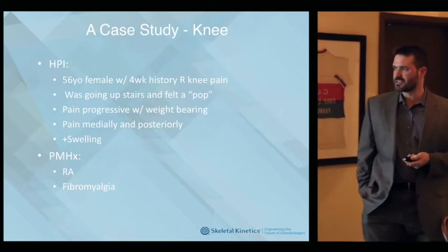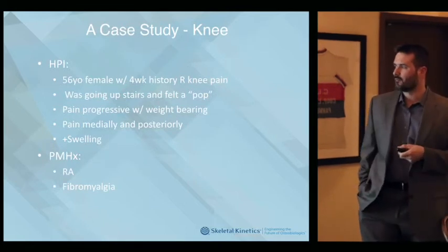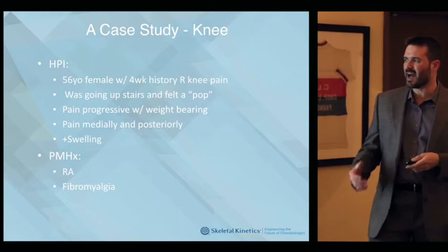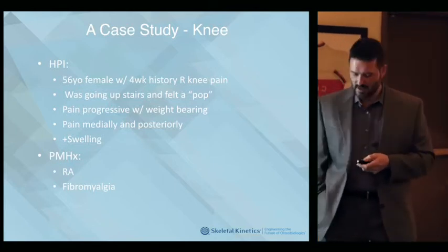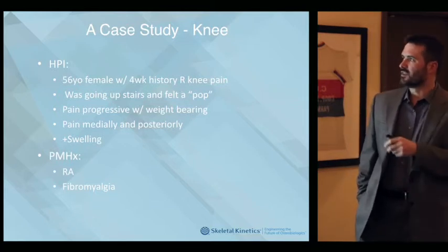And like I said, you can see this on the fluoroscopy, the shadow. I have not had any repeat MRIs, but I'm sure there are guys that have. It would be a good study to provide. But here's a case study.